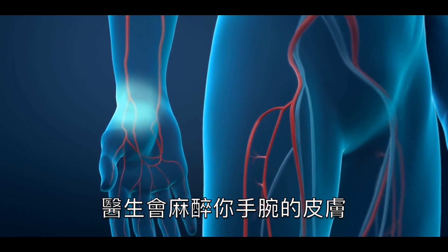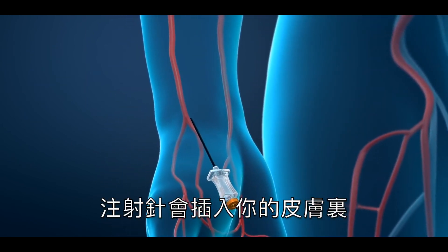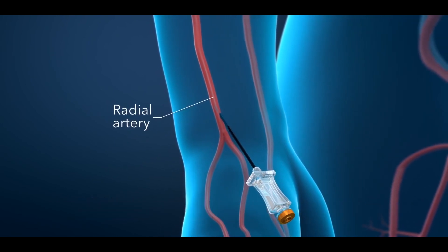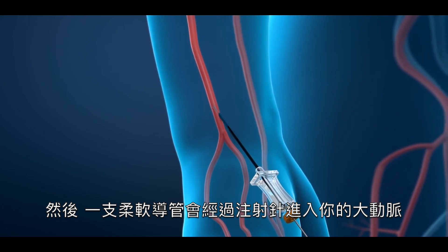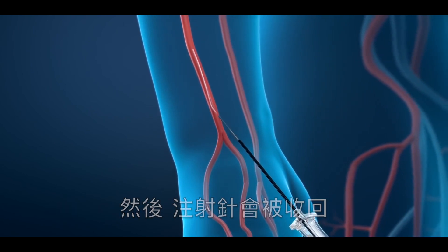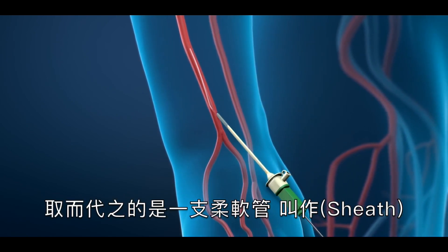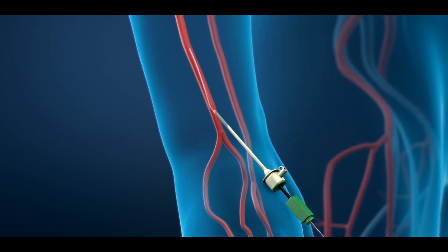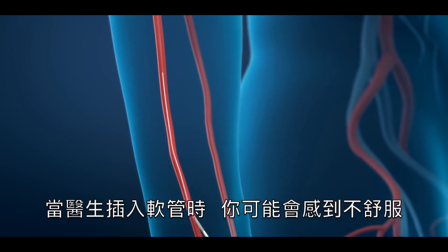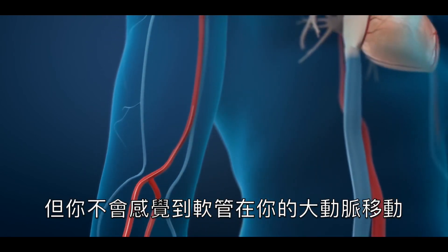To begin the procedure, the doctor will numb the skin in your wrist. A needle will be placed through your skin and into your radial artery. Next, a flexible guide wire will be passed through the needle into your artery, then the needle will be withdrawn. It will be exchanged for a small, flexible tube called a sheath. This permits access into your artery. You may feel pressure when the doctor inserts the sheath, but you will not feel it moving inside your artery.